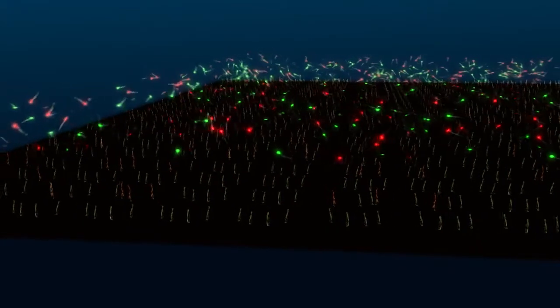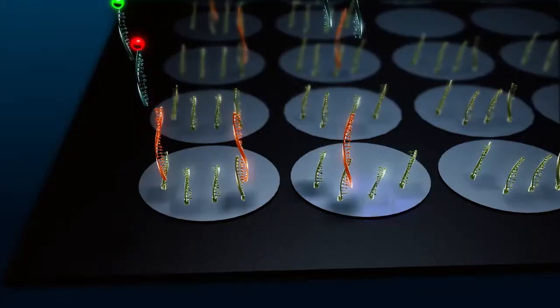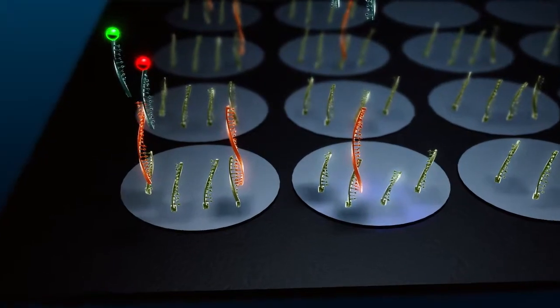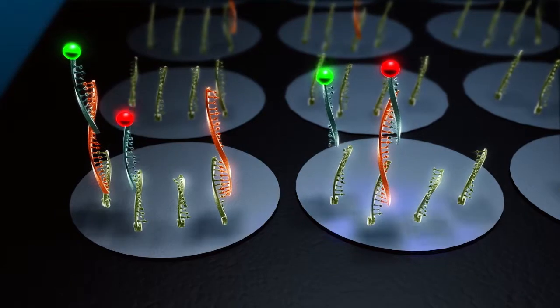Finally, fluorescent probes of different colors are hybridized to the target sequence, indicating the presence of a specific DNA signature in the sample.